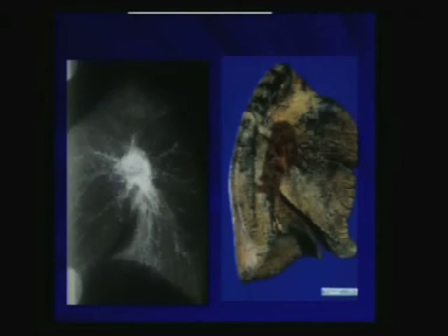If some people have attended some of my talks before, I do like to emphasize relying on the basic anatomy to be able to understand the pathology, especially pattern recognition. And this is a slide that I obtained over 30 years ago, at a time when CAT scan just came along, and it allowed us to evaluate the lung parenchyma and try to understand the anatomic structures and the basis of pathology.